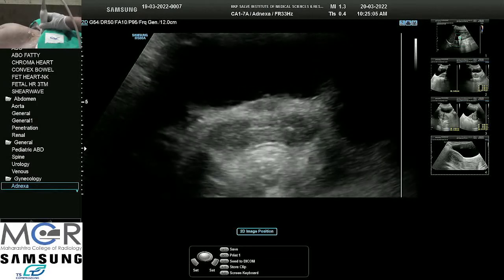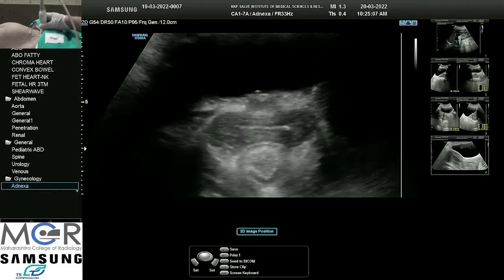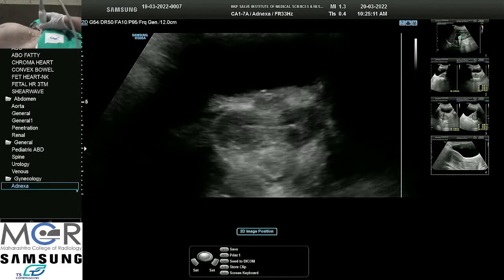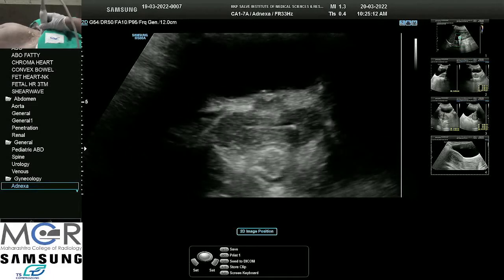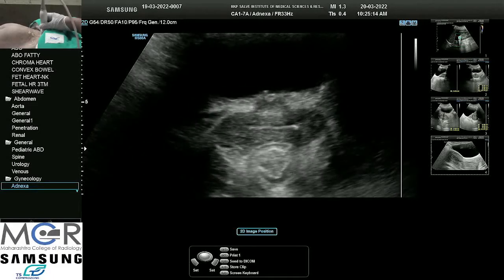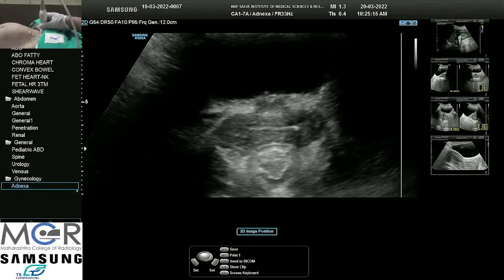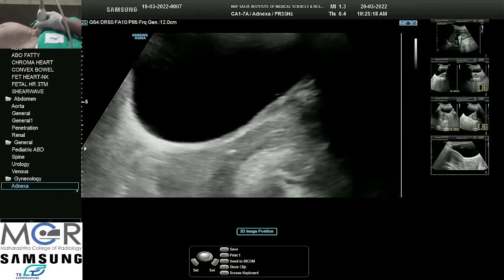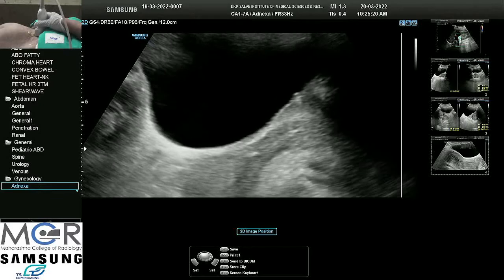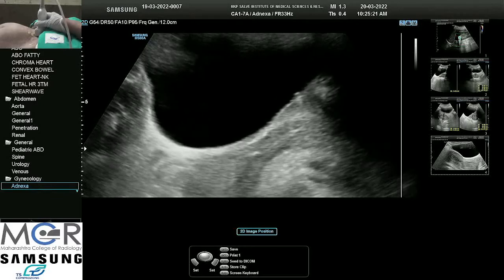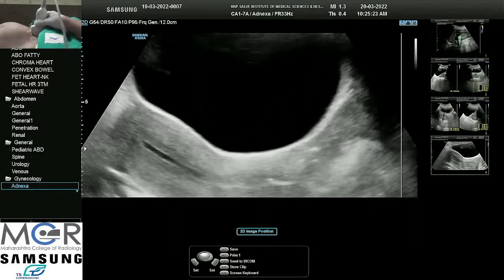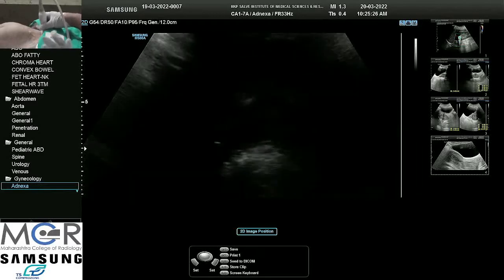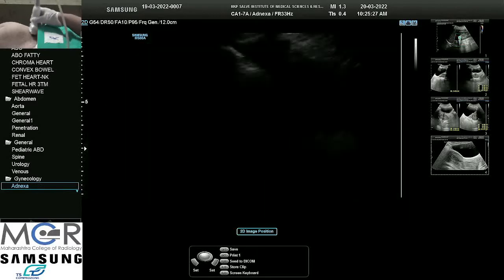Before we start, we have set the preset to gynec preset. Nowadays machines come with presets, so ideally we should be using the preset meant for the examination. If harmonics are to be used, there are various settings on the screen. All these settings should be done before we take the patient. Here we have done the settings properly.